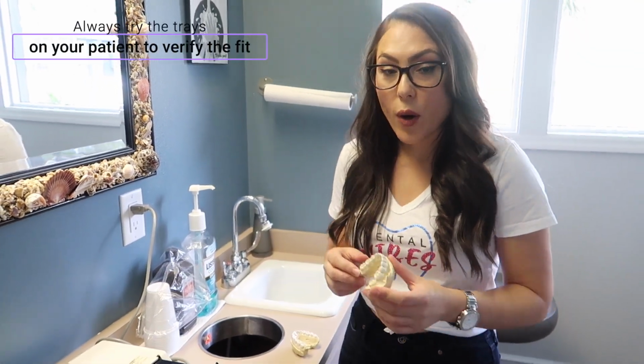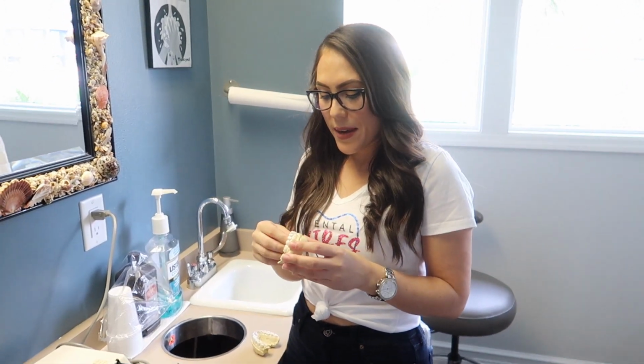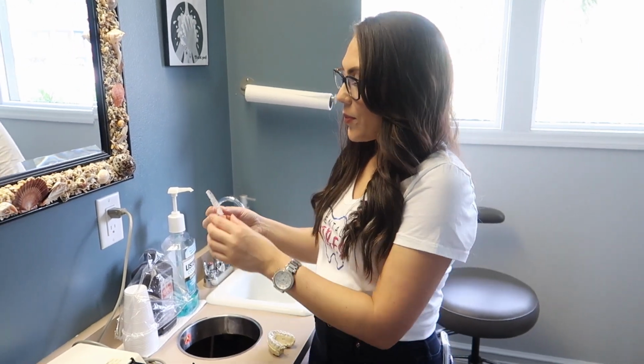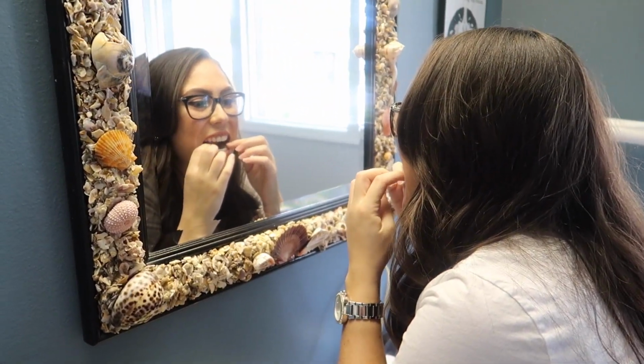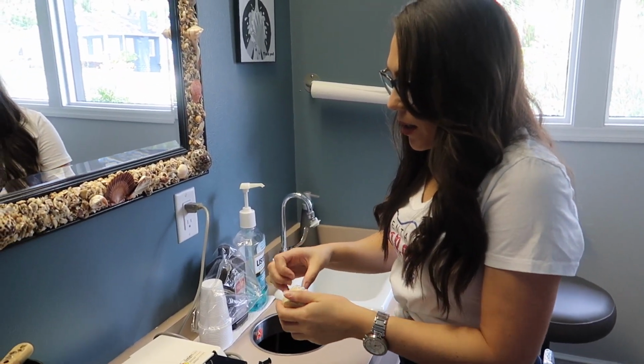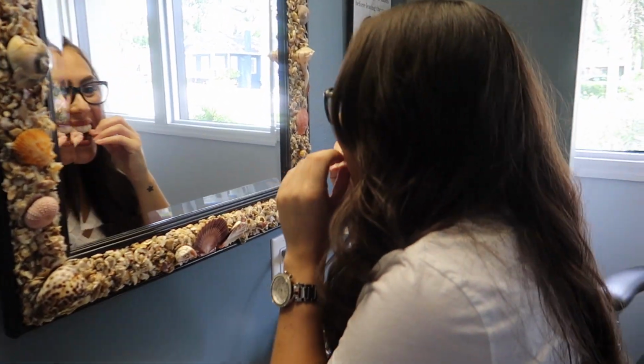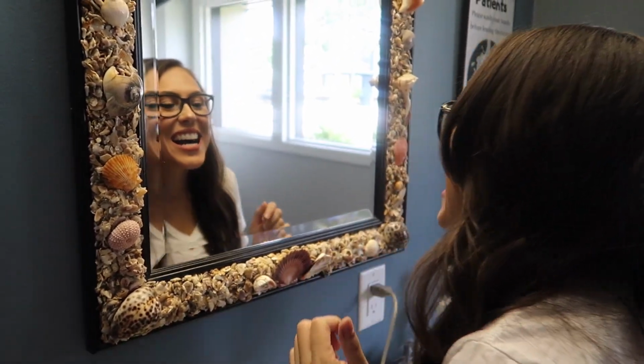As I mentioned before, you always want to make sure to try the bleaching trays in your patient's mouth to make sure they fit. So, moment of truth. Remember, we fixed the incisal of the lower tray. Let's see how it's going to fit. Oh my god. It fits? Yay! Okay, this is the top, and it's super tight, so that's good. There we go. Perfect.